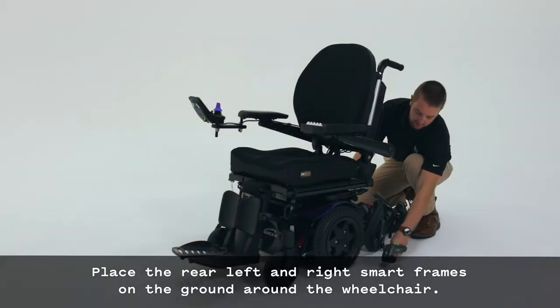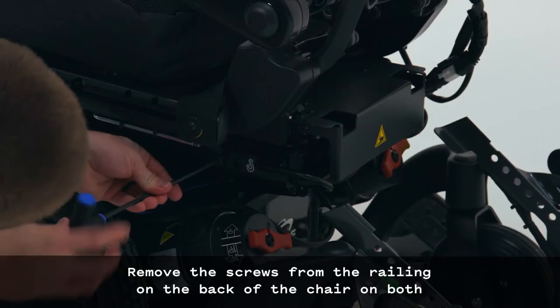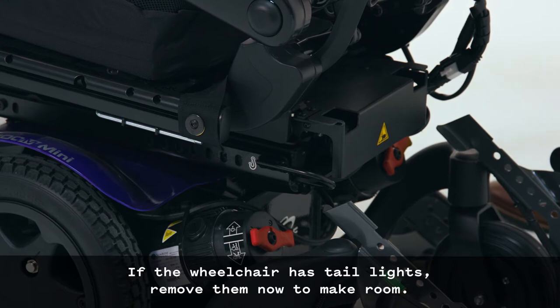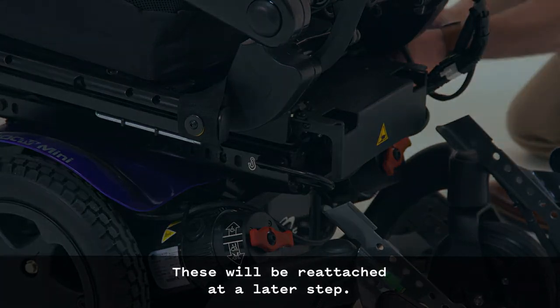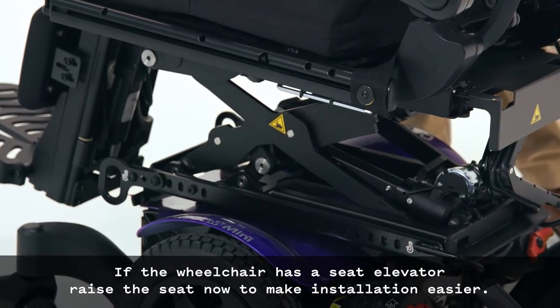Place the rear left and right smart frames on the ground around the wheelchair. Remove the screws from the railing on the back of the chair on both sides with a 5mm Allen wrench. If the wheelchair has taillights, remove them now to make room — these will be reattached at a later step. If the wheelchair has a seat elevator, raise the seat now to make installation easier.